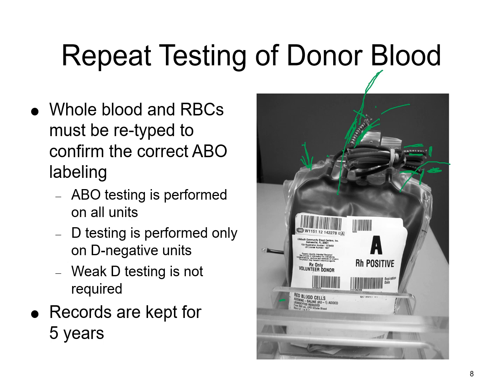But the segments themselves, you will pull one of these off, and then that's what you would use to actually do your testing for your blood type, your retype, or if you're doing your cross match, then you would use one of these segments to actually do that cross match testing. And there's usually several on there, so you have enough to do multiple cross matches. So if you cross match for one patient and it's not used and you put it back into inventory, then you could test it for an additional patient.